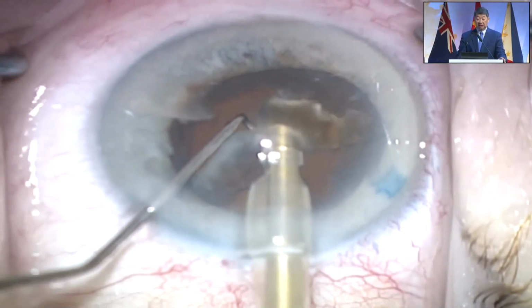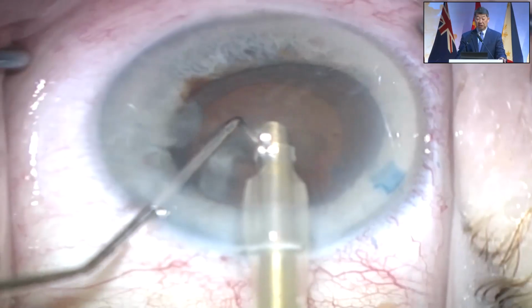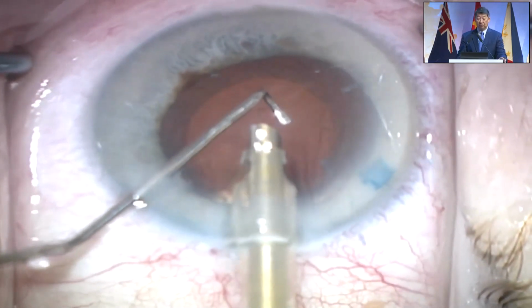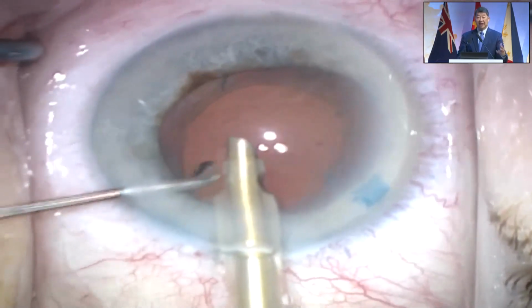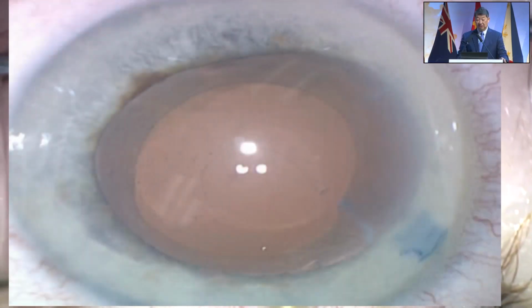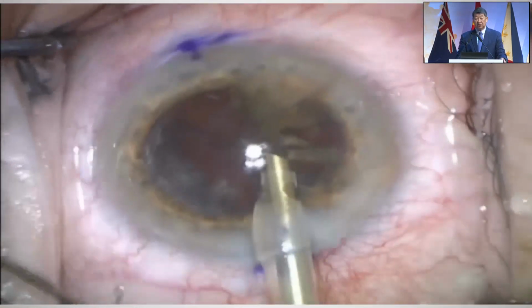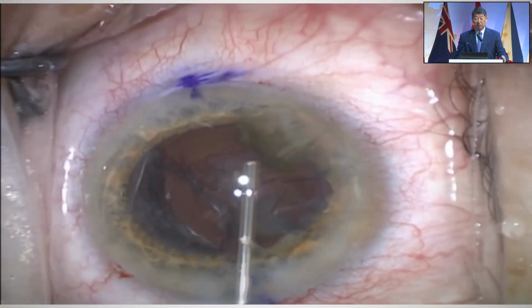Now, look at the posterior capsule. I know it's a zonulopathy. I'm trying to guard with my chopper, and I move it just right there. And you see I aspirated that. Why did that come up so quickly? And there, you can kind of see in the middle, I have a puncture in there. So what I should have done is stopped around this point and filled the bag with dispersive.